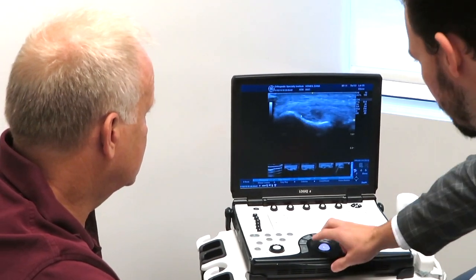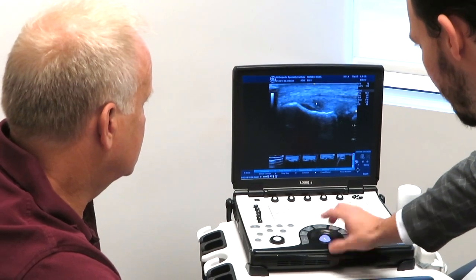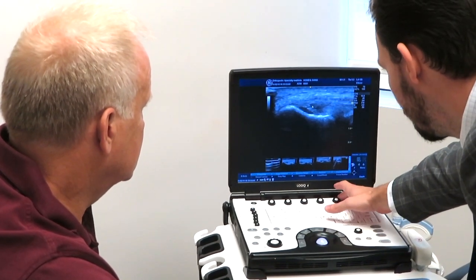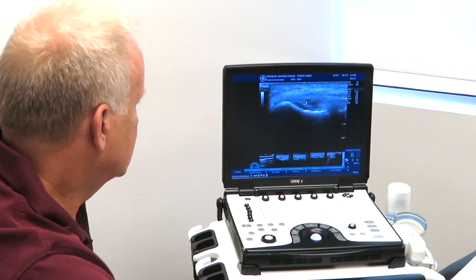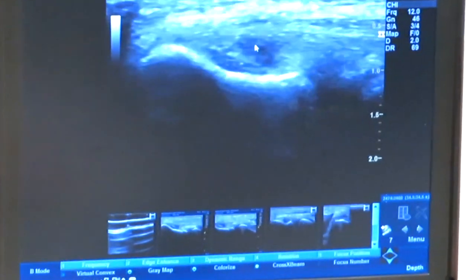And right around there, we start to notice that there is a little area of irregularity right where the tendon attaches. Right around there where the arrow is, is where we have an area of partial tearing with tendinopathy.